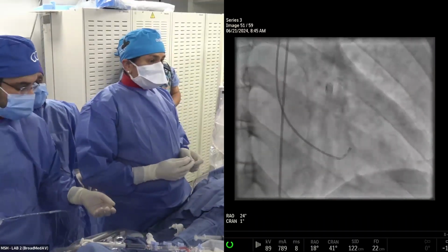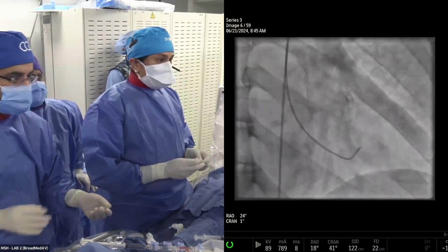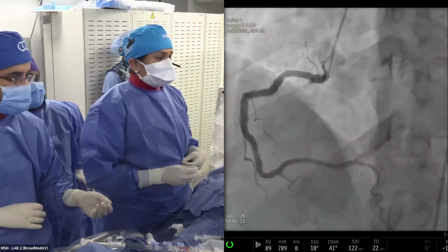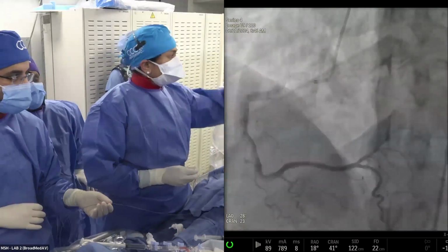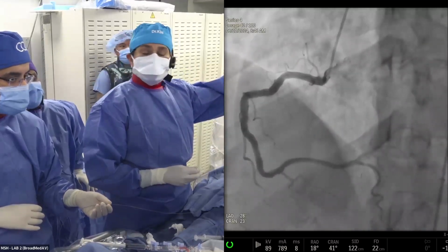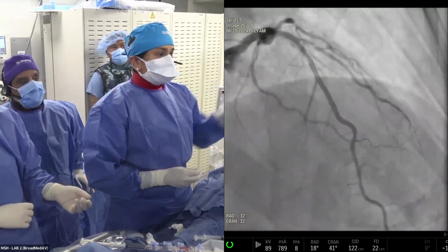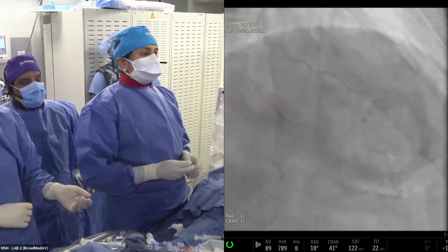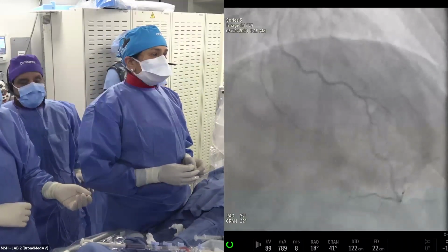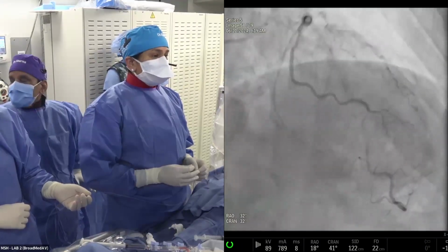So you can see the EF near normal, 50%. EDP was 10. Very good. The right coronary artery is well treated with patent stents. I think the stents were Synergy XD put in a few weeks ago, completely normal after rotablation. And this is the left side. Proximal LAD, you can see moderate calcium, and then actually there's significant disease in the diagonal. There's also a stent in the diagonal, but the disease is proximal to the stent.